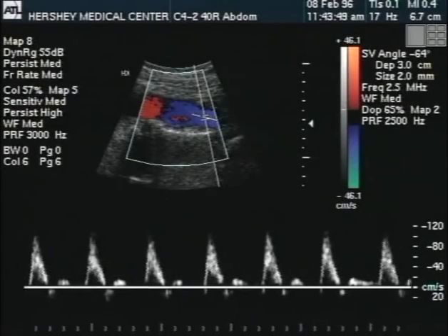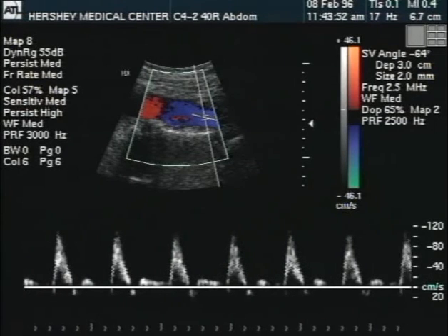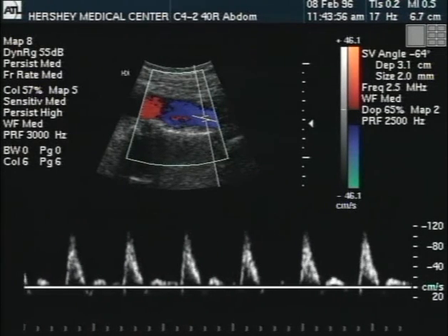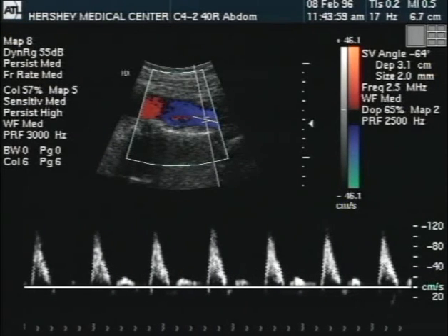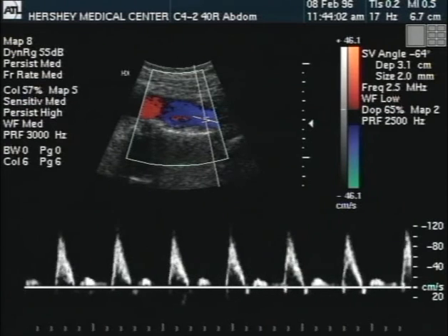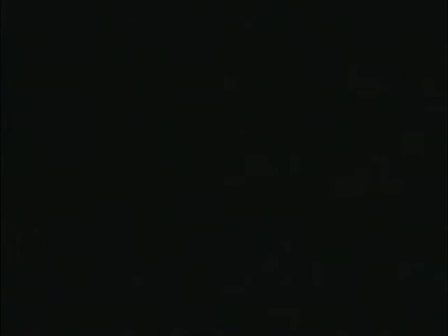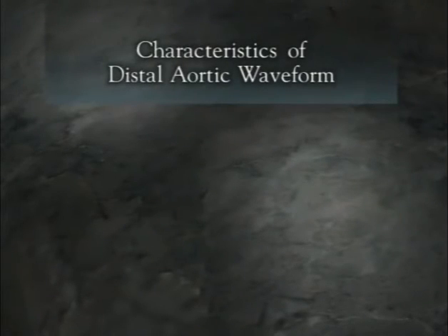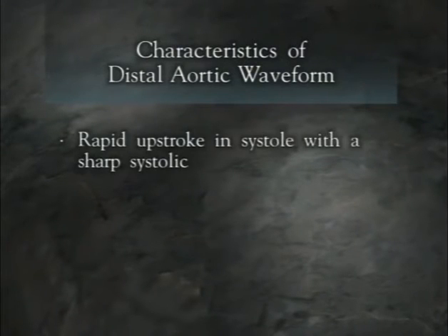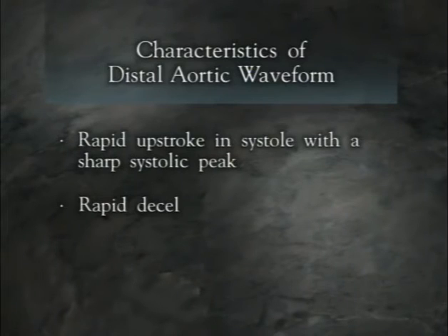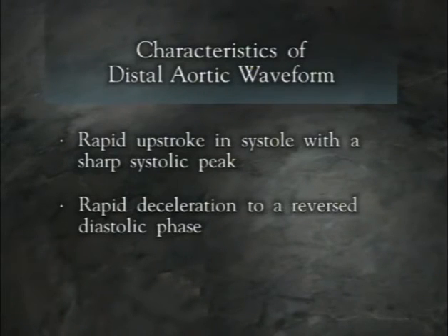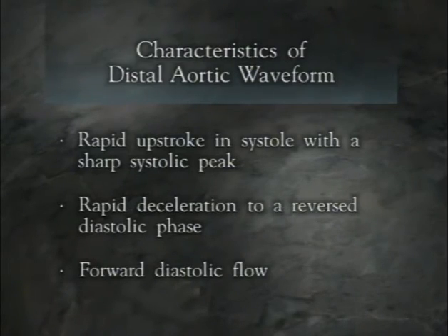Below the level of the renal arteries, the aorta supplies flow to the lumbar arteries and the arteries of the lower extremities. These vessels supply the high resistance muscular bed of the hips and legs. For this reason, the flow pattern in the normal distal aorta will mimic that of a peripheral artery. This waveform can be recognized by rapid upstroke in systole with a sharp systolic peak, rapid deceleration to a reversed diastolic phase, and forward diastolic flow. In elderly patients, or patients with reduced vessel wall elasticity, the signal may be biphasic, lacking the forward surge in diastole.